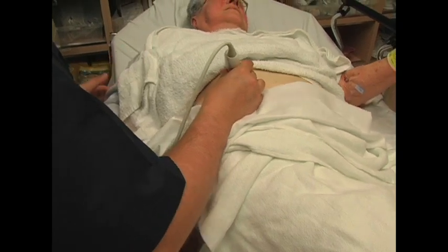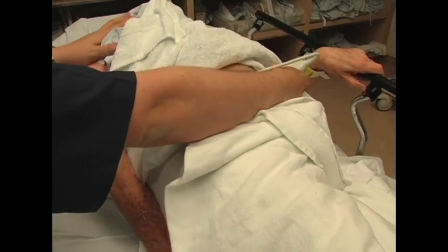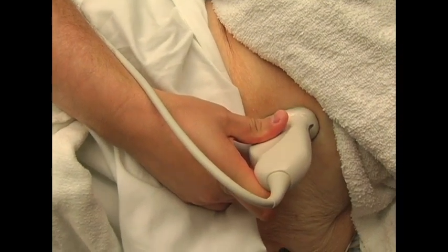Another technique that's often useful if the gallbladder can't be seen due to bowel gas is to have the patient turn onto their left side. This moves the bowel gas out of the way and brings the gallbladder closer to the anterior wall of the abdomen.